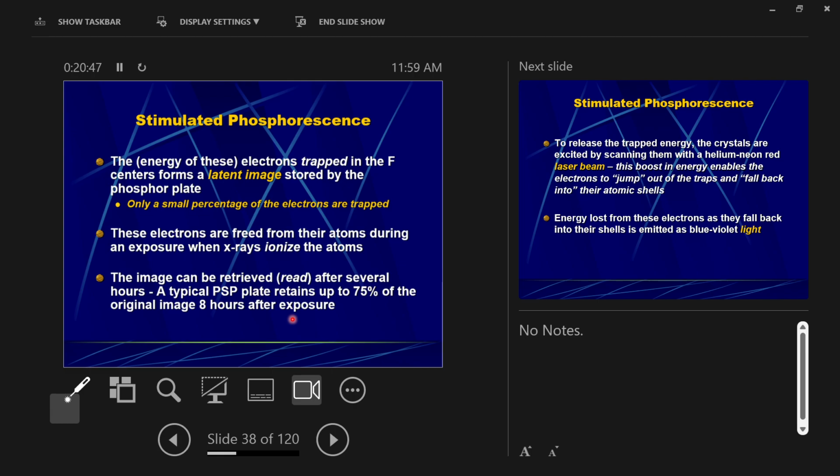They erase naturally after 24 or 48 hours, which would mean that if I wanted to keep using that processor and not fix it, a student would make an exposure, look at the image, and then they couldn't make another exposure for 2 days. Now, if you only have 2 image receptors, typically it's normal to have like 2 14 by 17 image plates and 2 10 by 12s, right? That we kind of switch between as you're going through your exam. Sometimes you've got 10 or 12 image receptors.